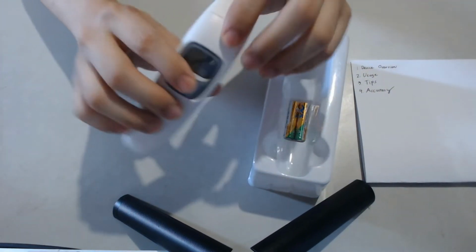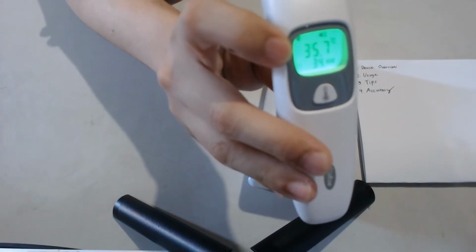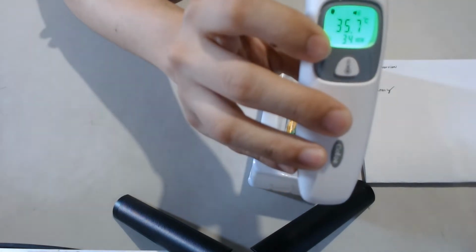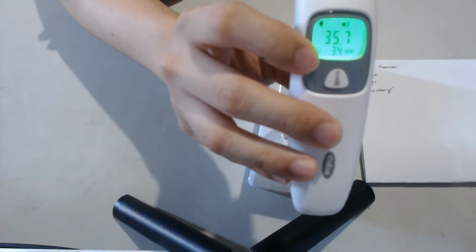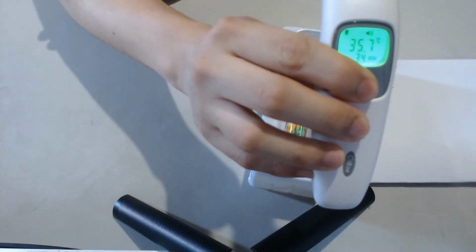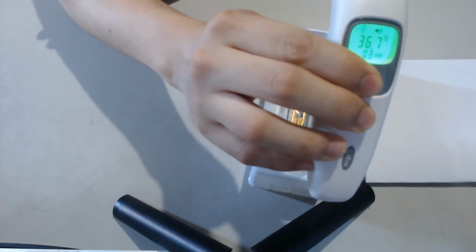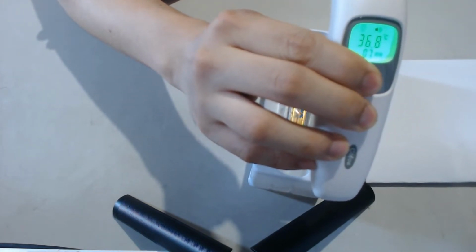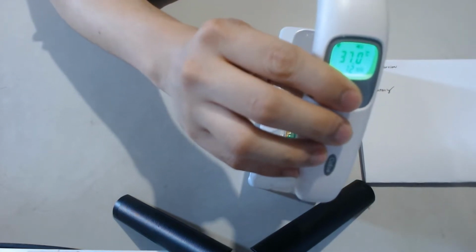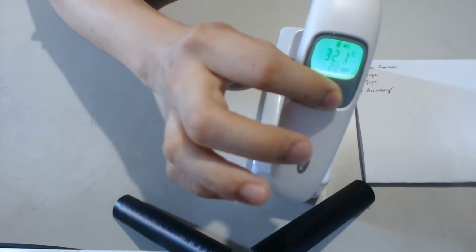Now for the in-depth usage. As you can see, there are two rows of numbers. There's the temperature and what is that at the bottom? This actually has a memory function. To access the memory function, you simply hold the button for 2 seconds. 1, 2. There. You're now in memory and you're able to review the previous memory by pressing the single button. It will scroll through all. This can store up to 50. So you can imagine it's kind of unwieldy. You have to keep on pressing and pressing to get to number 50.